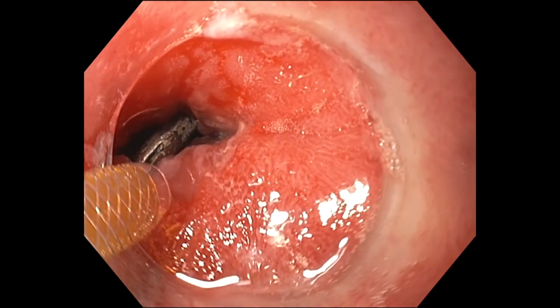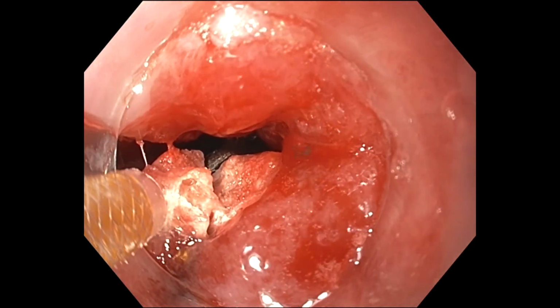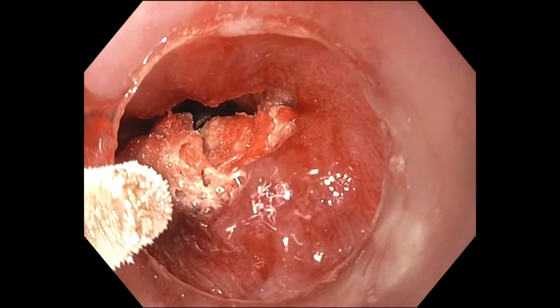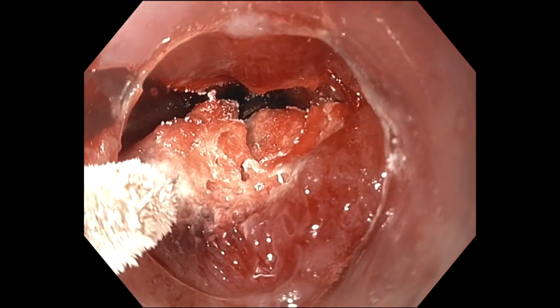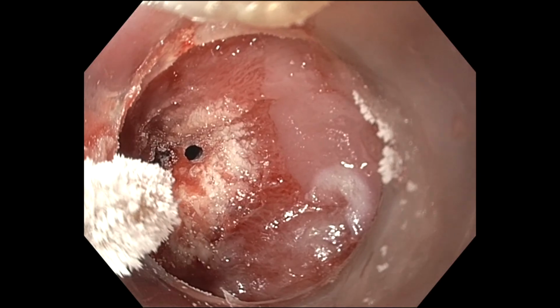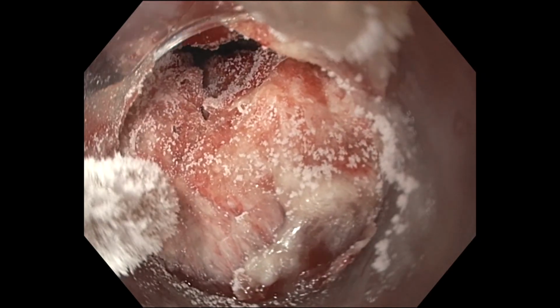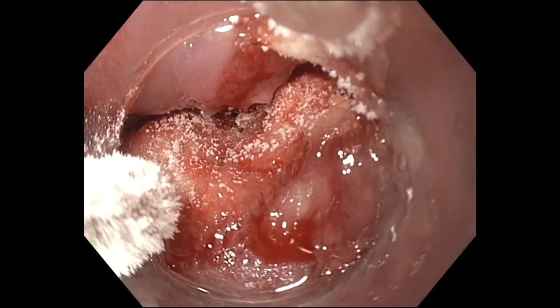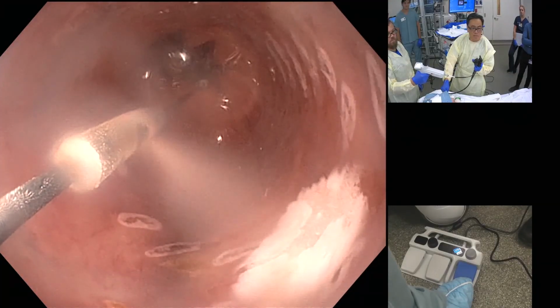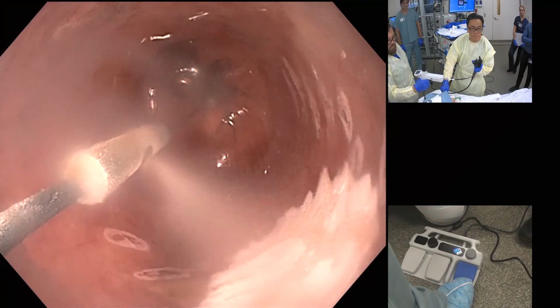Now this is cryotherapy, which sprays liquid nitrogen over the mucosa, getting the temperature down to minus 196 degrees Celsius. Now that is super cold. And we freeze and thaw and freeze and thaw to ablate the Barrett's. Alternatively, we can use a balloon catheter to spray nitrous oxide and bring the temperature down to minus 89 degrees Celsius.